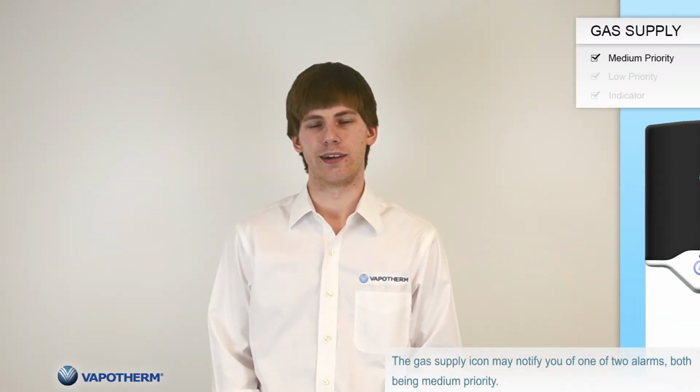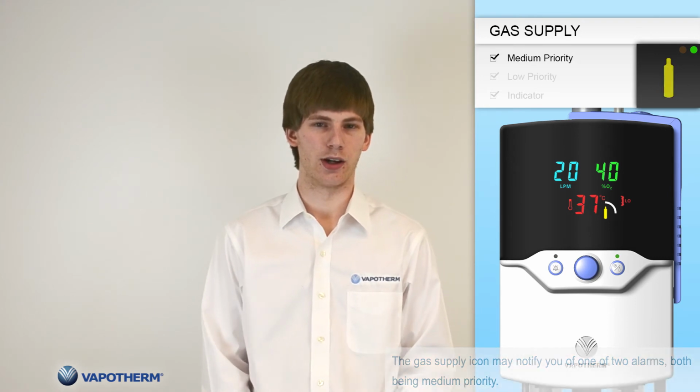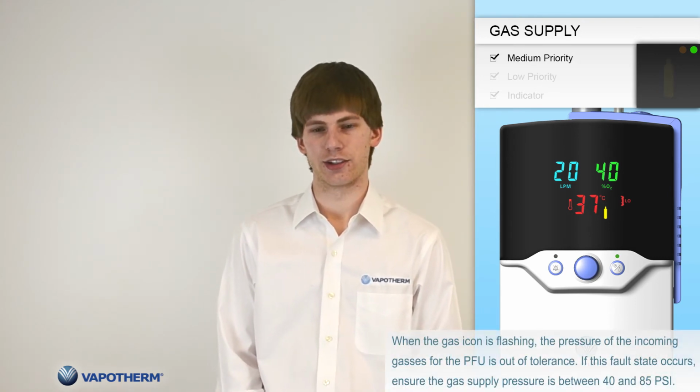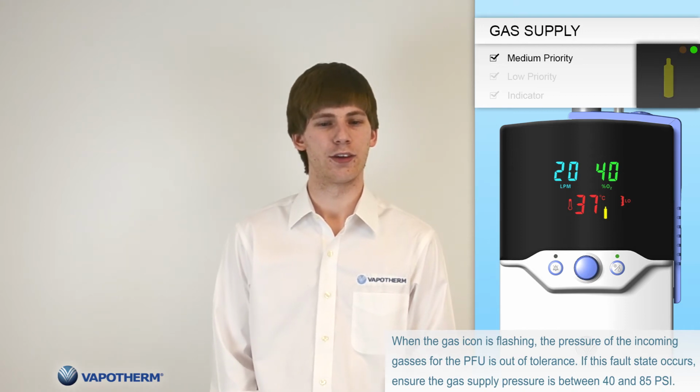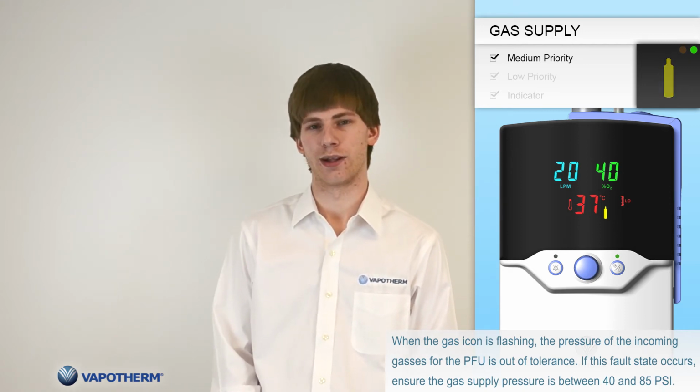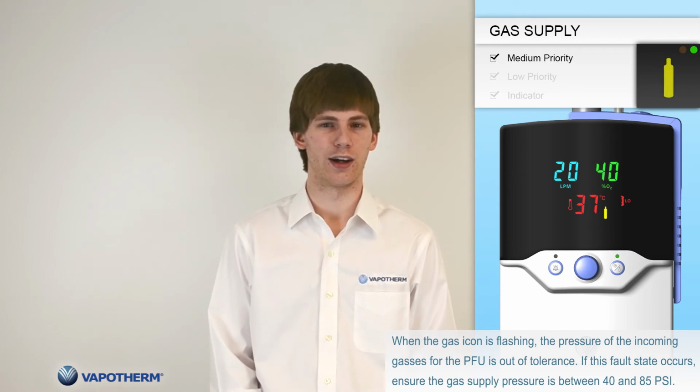The gas supply icon may notify you of one of 2 alarms, both of which are medium priority. When the gas icon is flashing, the pressure of the incoming gases for the Precision Flow is out of tolerance. If this fault state occurs, ensure that the gas supply pressure is between 40 and 85 psi.